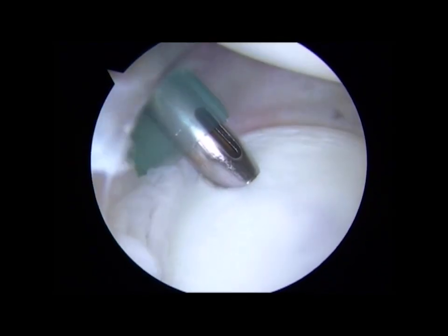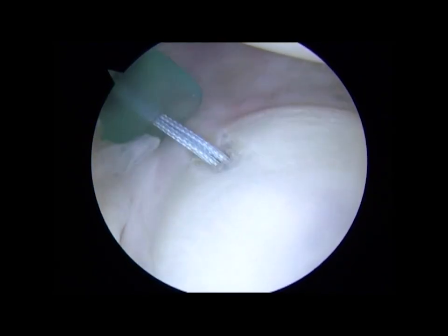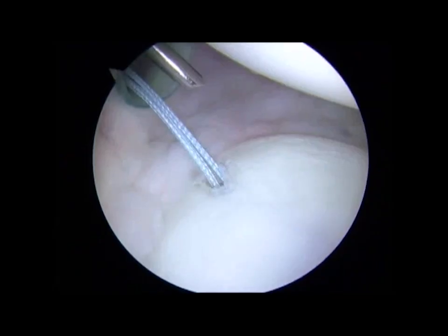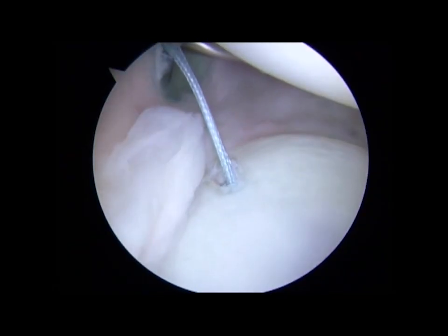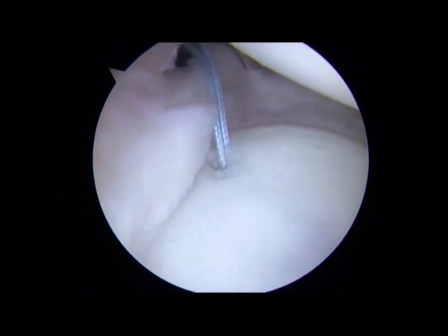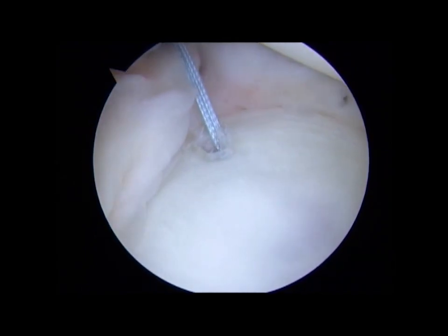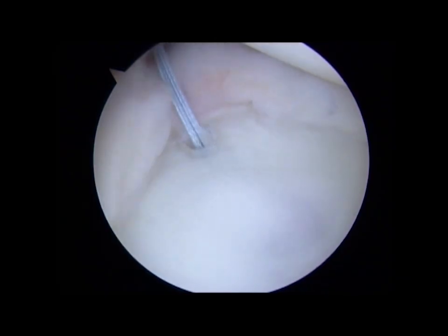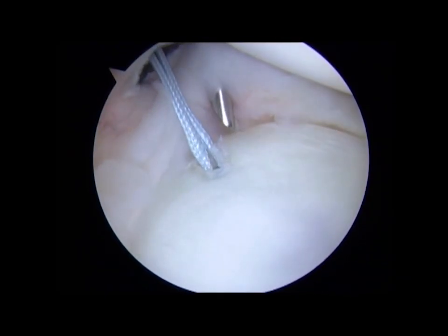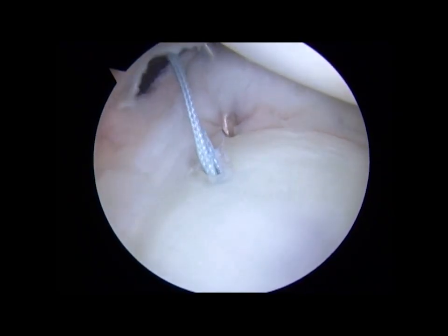After that's accomplished, we can see here yet another challenge in multidirectional instability capsulorrhaphy in patients with no labral pathology. As you can see here, this retrieval device is used to do a pinch and tuck technique where the capsule is pinched in a through and through fashion, and then this device is redirected to try to incorporate the labrum.